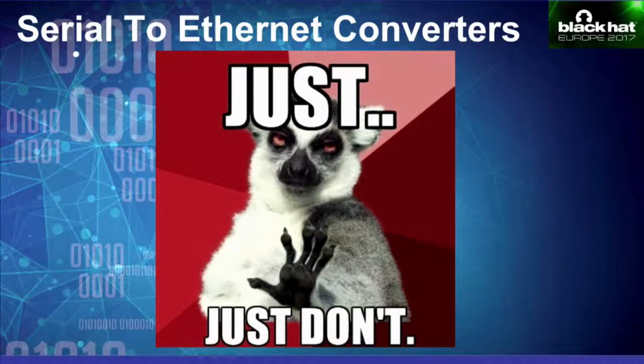So, like I just mentioned, a lot of these devices, which are older, like your ECG machines, your MRI machines, are now connected to the network. Since they are legacy devices, they were never meant to be connected to the network, and the way they are connected is using a hardware called a serial to Ethernet converter.